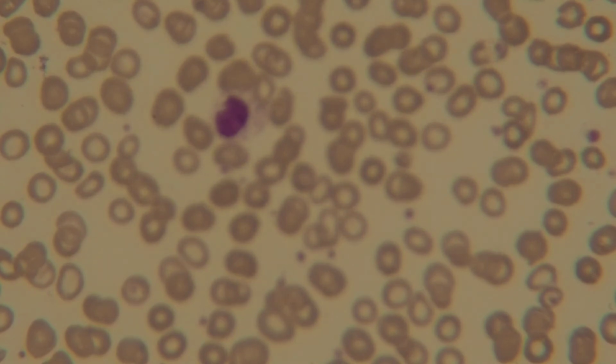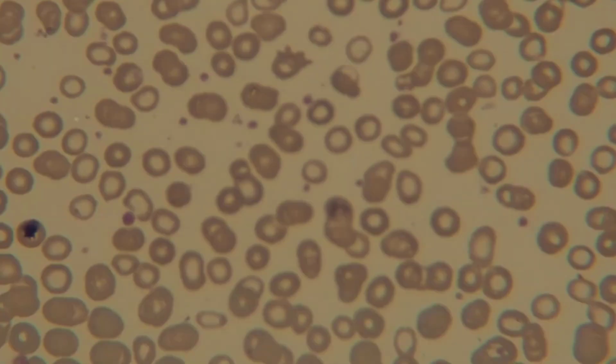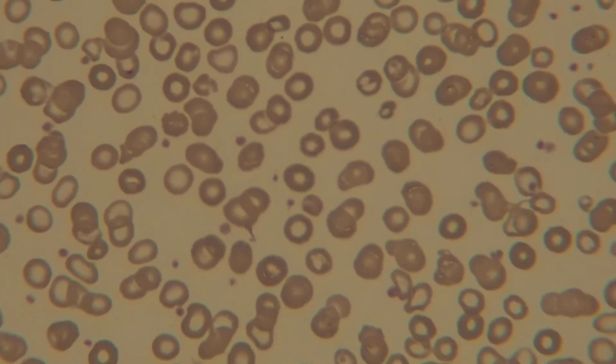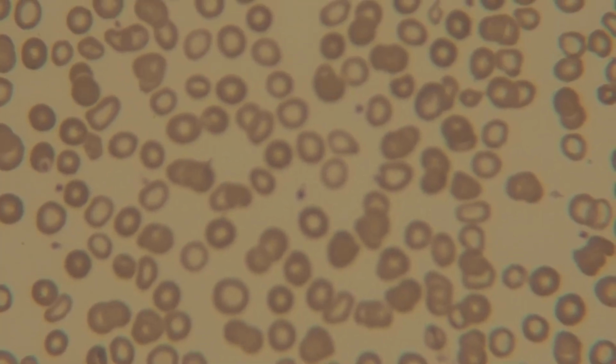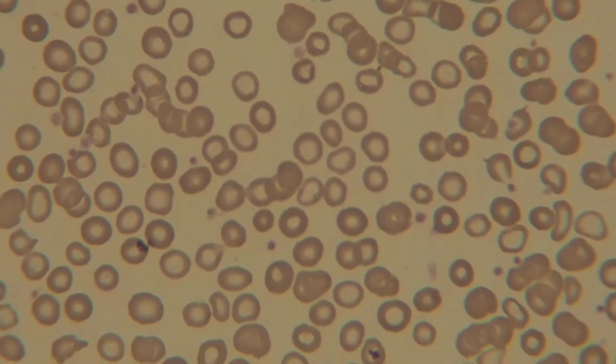It's a neutrophil, it's just coiled wrong. I cannot see the segments. I'm not going to count that one.